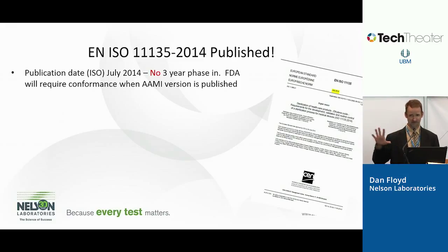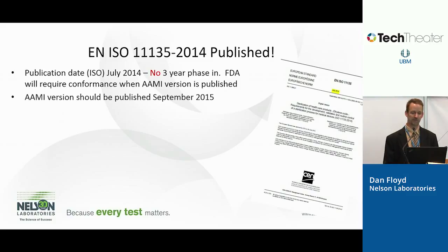However, at the AAMI meetings this last May, just last month, the FDA said they were not going to allow a 3-year phase-in period, and that they would require conformance with the document as soon as the AAMI version is published. The schedule for that is September of this year, September 2015. And so some people may have to scramble a little bit.